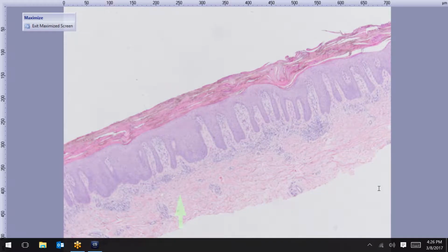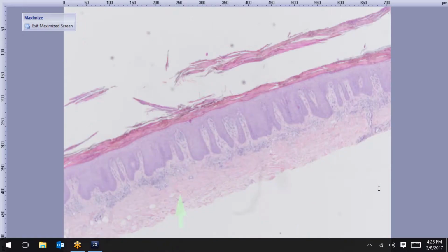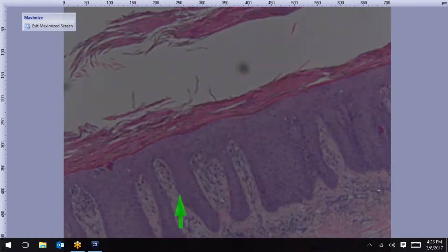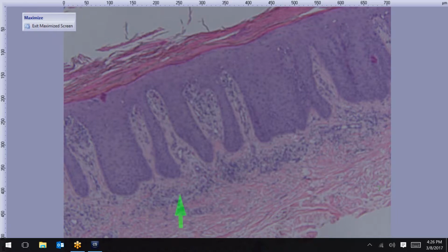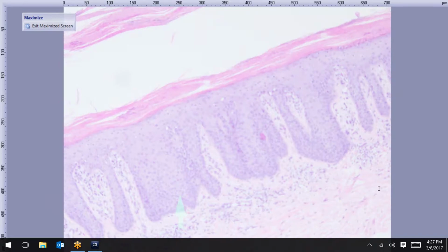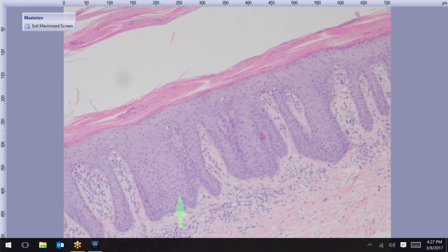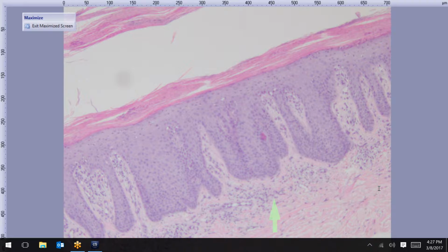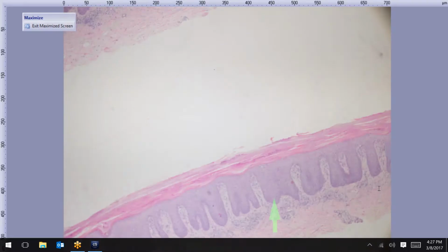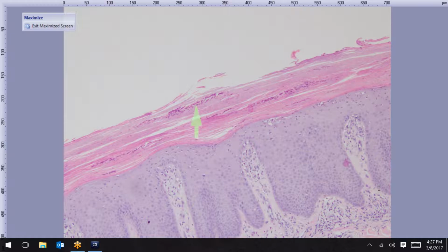All right, anyone know what this is? Oh, let me get that back in focus here. Yeah, that's right. This is the most regular acanthosis that you'll see. So you could draw a straight line under it. So this is a perfect textbook case of psoriasis. But just to revisit it, you've got these little aggregates of neutrophils.